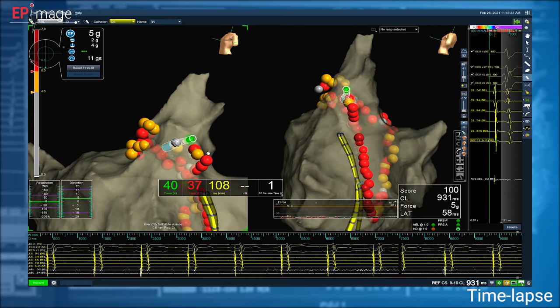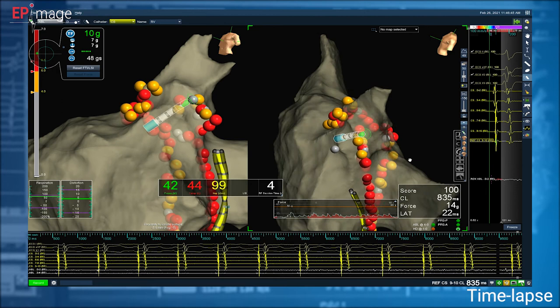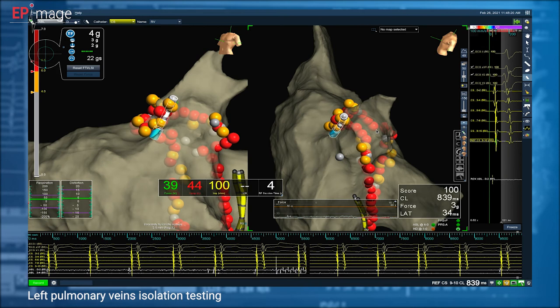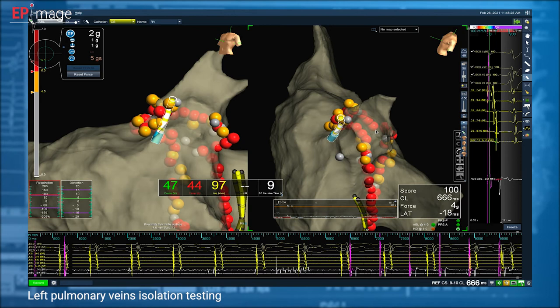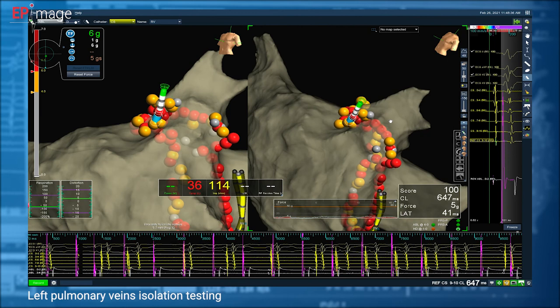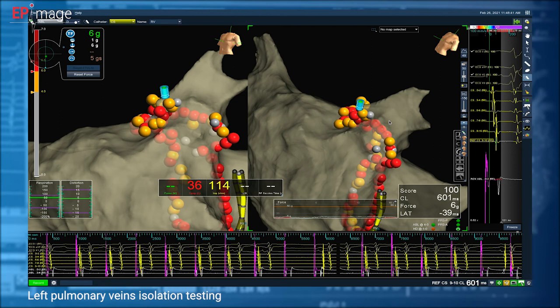What you can see on this picture is that the diameter of each application is around 5 millimeters. So this left atrium is huge. It's really huge, 57 millimeters in diameter, and the distance between the veins and the veins themselves are so huge that we have to perform lots of applications.